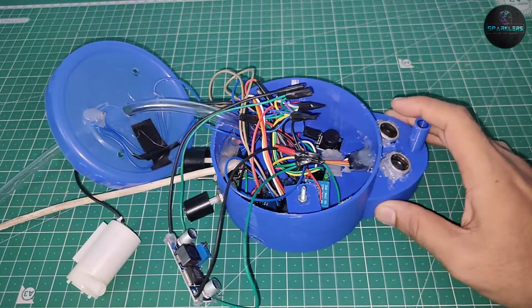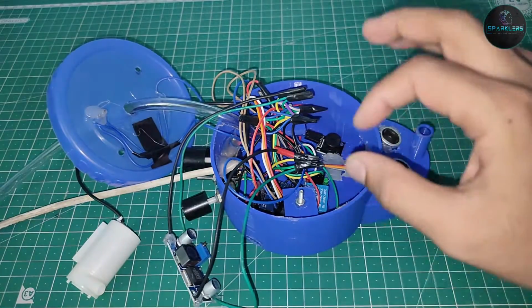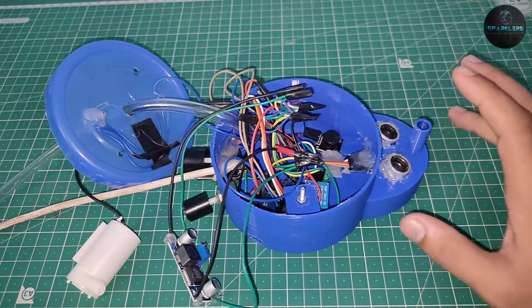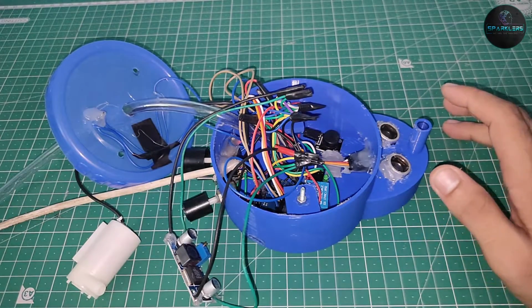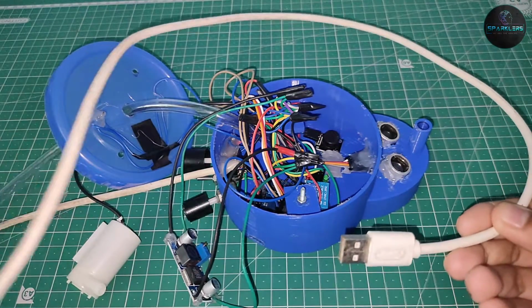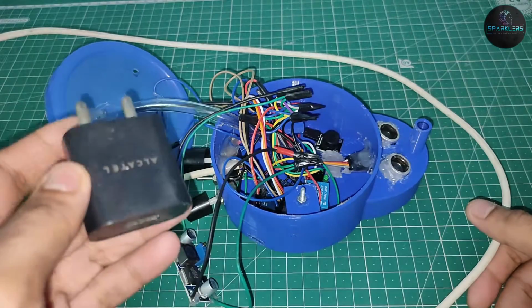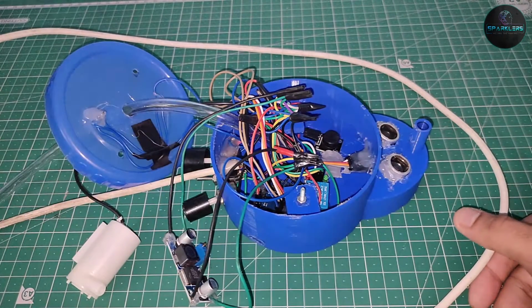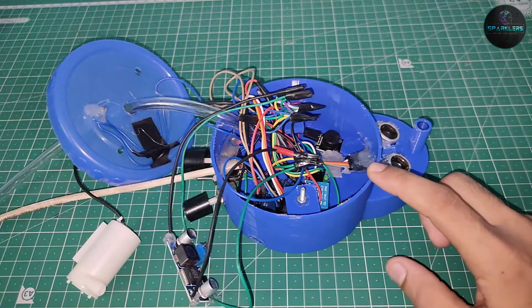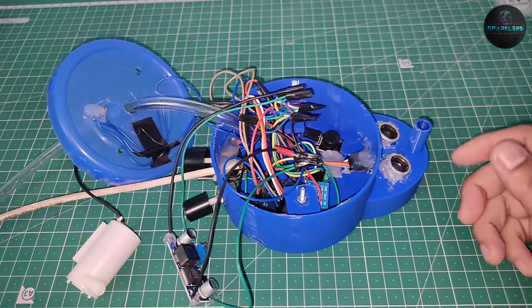Okay, so here I have connected everything, and this is how it looks. Now I know it's quite messy because it's just a prototype, so I'm just testing it this way. Now the first thing is the power supply. Like I said, I am going to use a 5-volt supply, using a USB cable like this, and I am going to insert it in one of these wall adapters. It gives 5 volts. The main advantage is that I can use it with power banks and small power supplies too. But you can use 12 volts also.